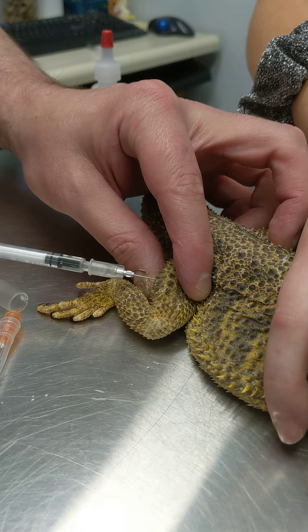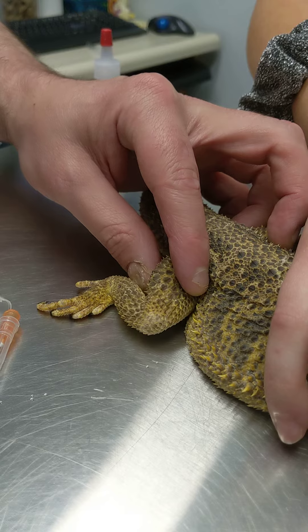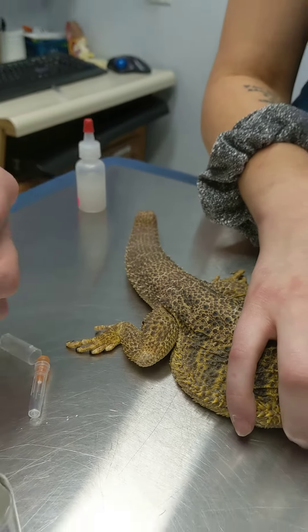Once we're in the skin, I'm just going to give that injection. Easy peasy. You see a little blood came back there — no big deal. And we're done.